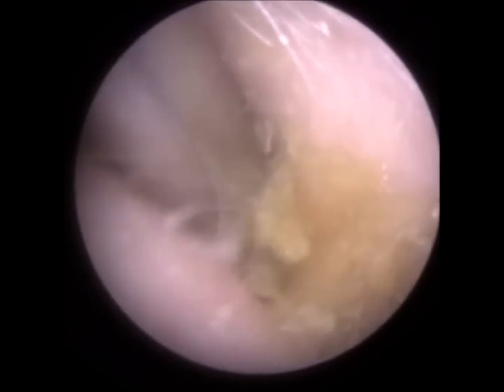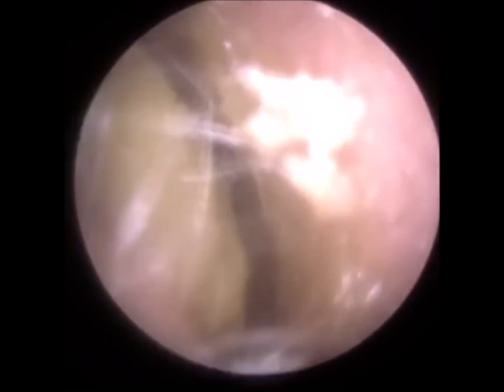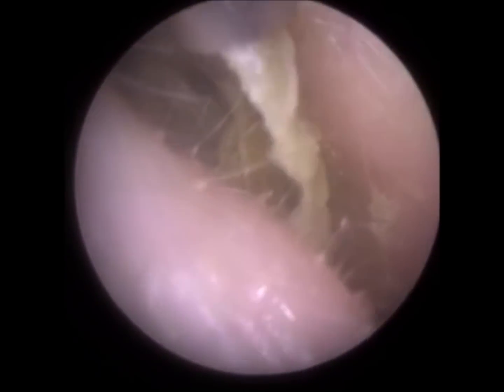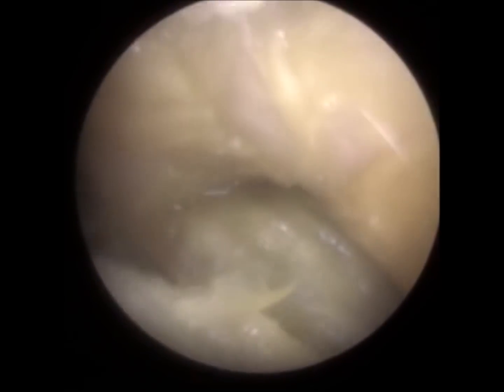And at other stages when I use forceps, the hope is that you grip onto this dead keratin and you pull it, and it comes out in big chunks. Sometimes it did, sometimes it didn't. Sometimes it just removed individual ribbons of this dead skin, and you'll be there all day otherwise, removing every individual layer of dead skin. So I've just gone back with the suction here, and you can see this is a single ribbon of dead skin. It's not coming out in a chunk. And there were probably hundreds of these little ribbons in both ears. I'm just going to wait until I use the forceps, and then I'm going to let you carry on watching it, because it will just be covering old ground.